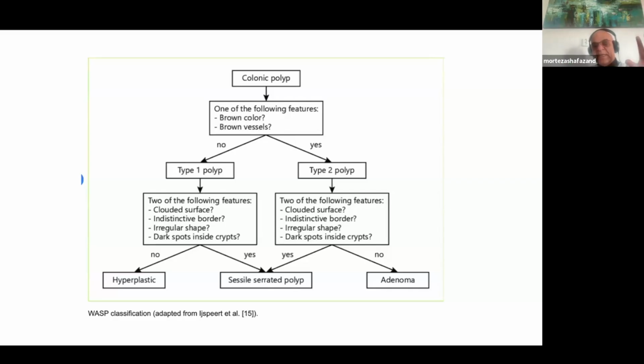So when I look at that area that is not liquid, the first thing I think with the white light is I see the mucus on the mucosa surface, which is on the opposite side of the liquid, because all this liquid should be on the right side, the lateral side.